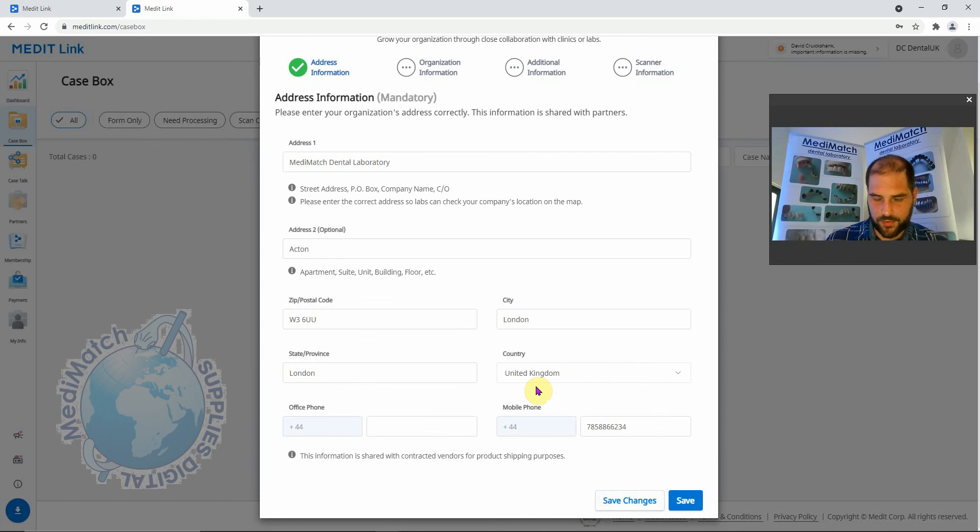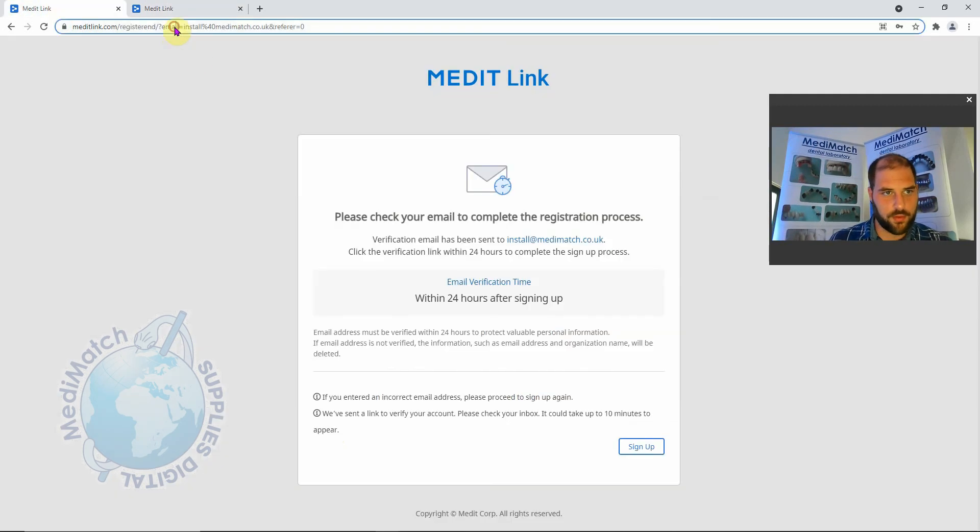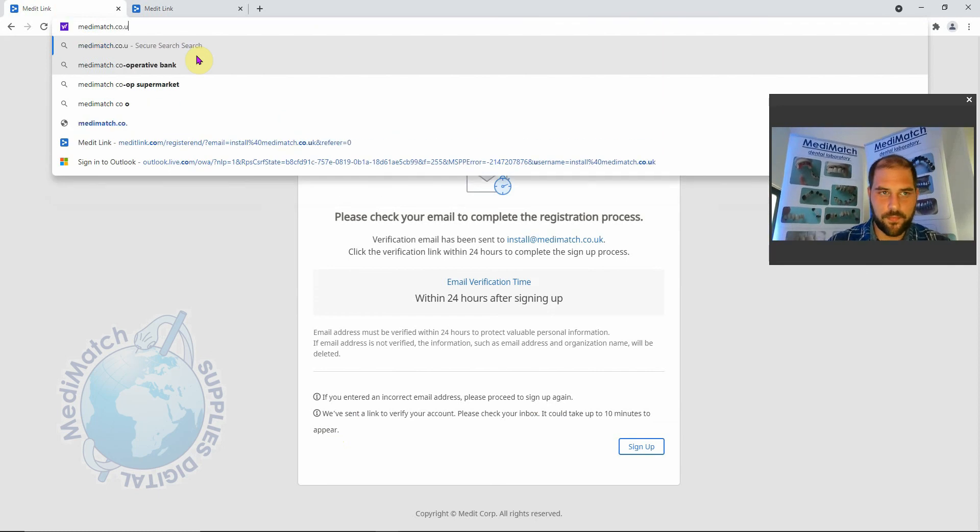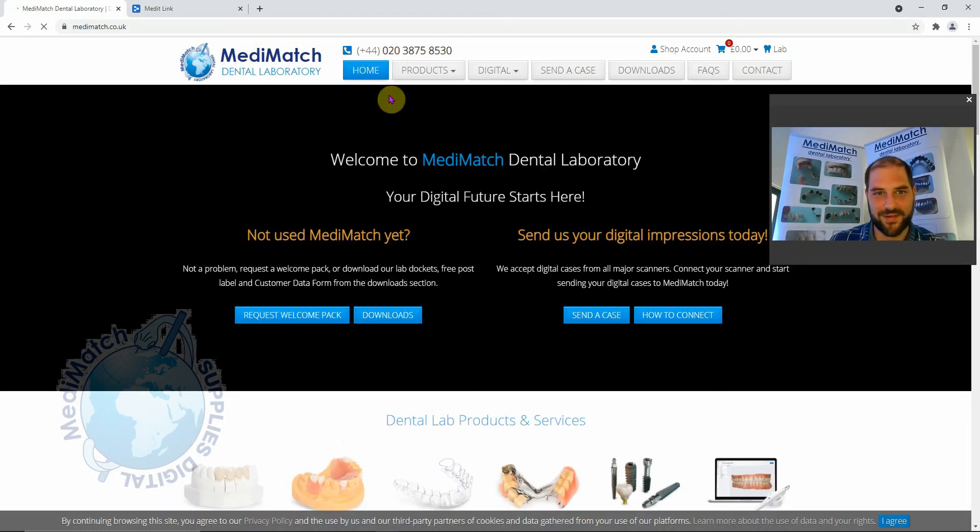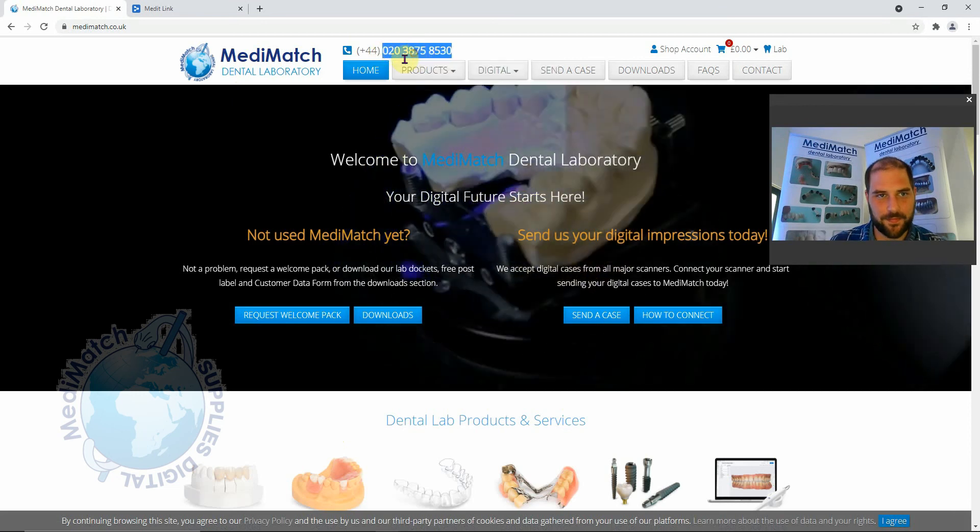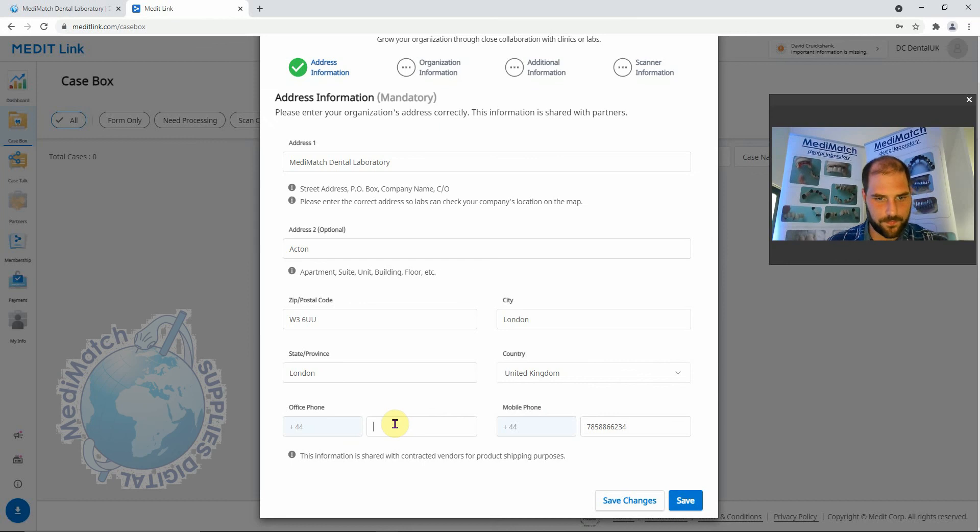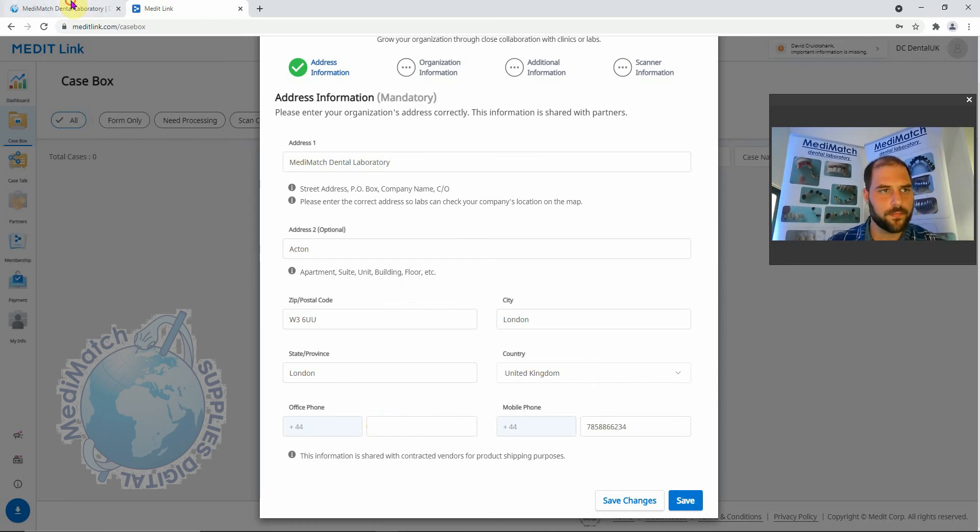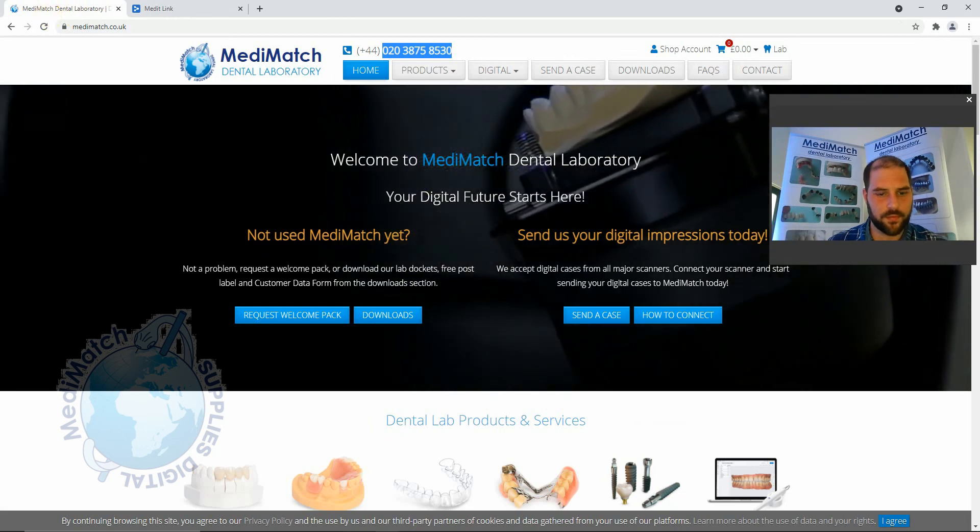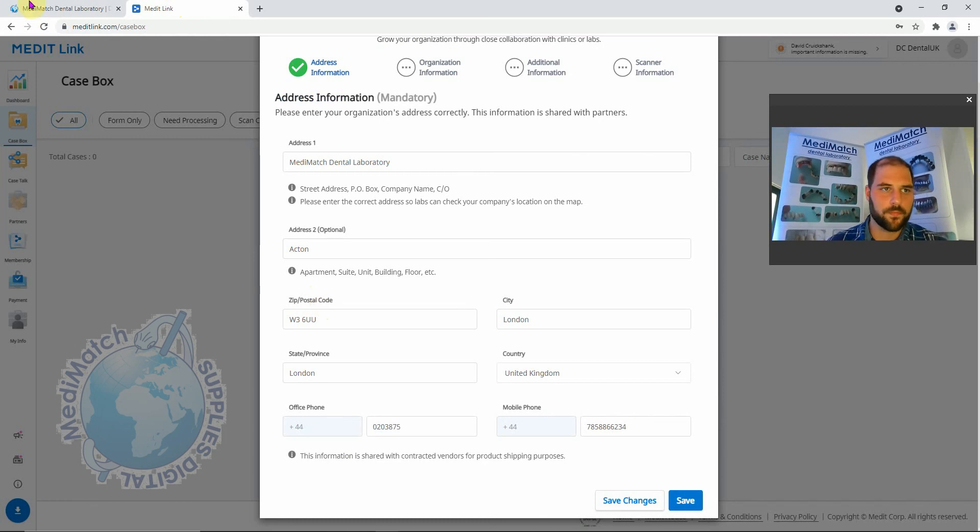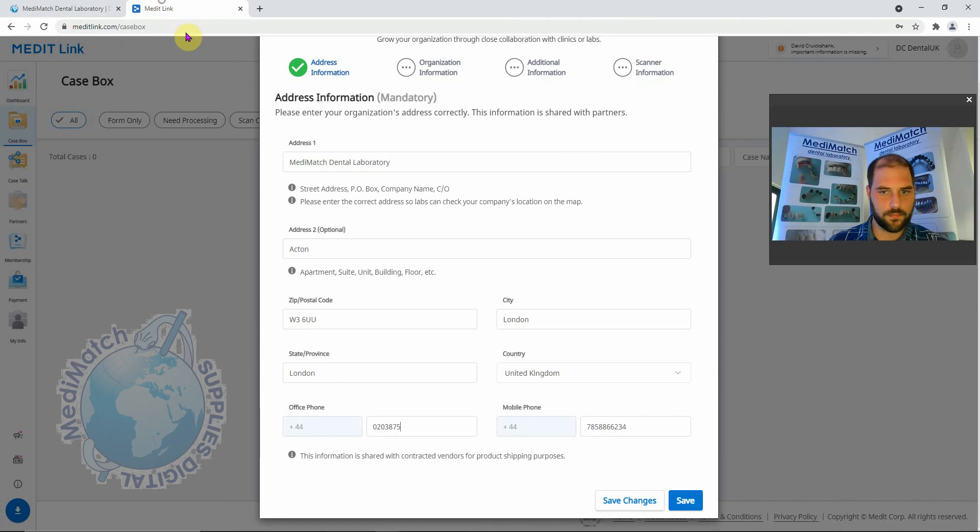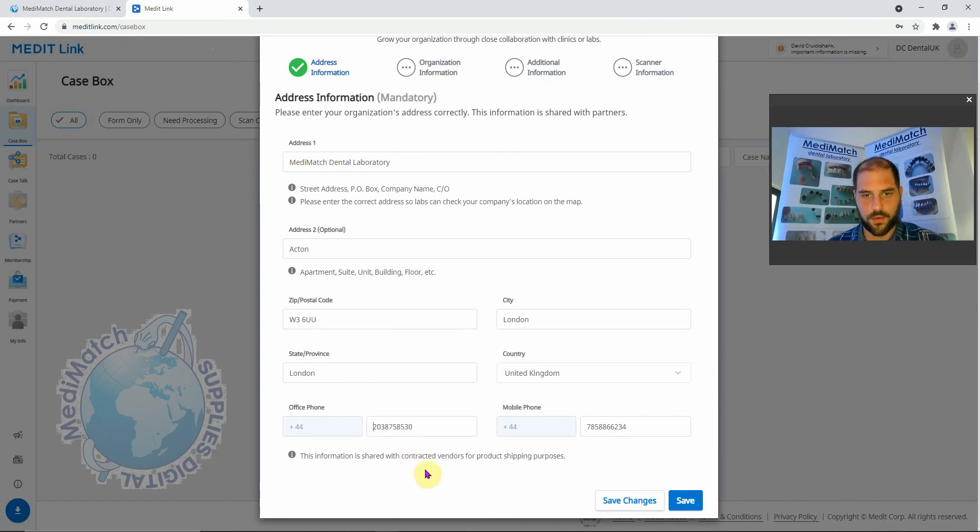Good chance to show you the Medimatch website. Okay, we've finally got that, so we click Save.